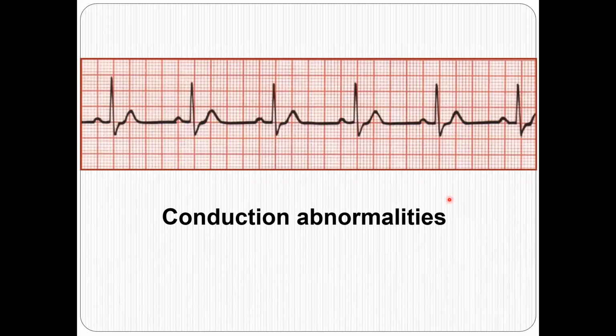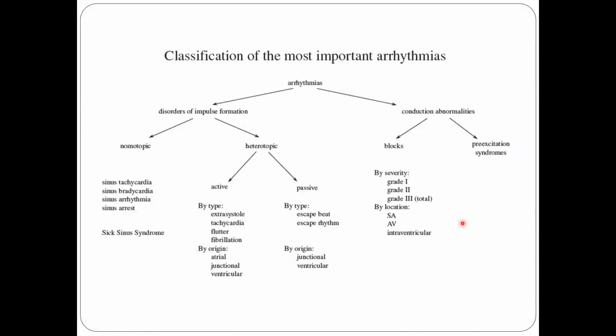As we did last time, right now we are going to summarize the important points of the conduction abnormalities. Basically, we started the arrhythmias last time. We discussed what an arrhythmia is: it's not a normal sinus rhythm. It can differ in rate, in rhythmicity, or in the impulse formation center. So this is one big chunk of the ECGs that we are discussing, the impulse formation abnormalities.